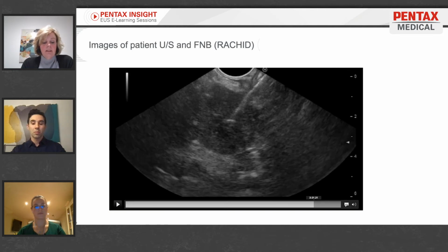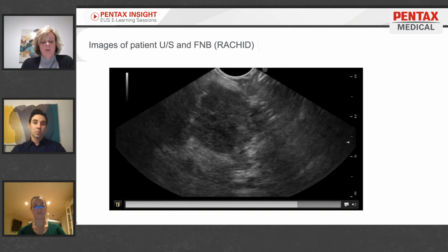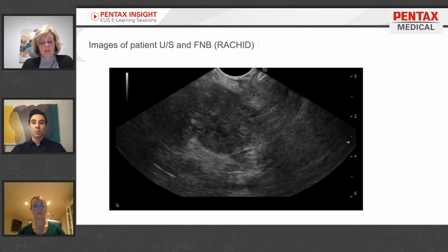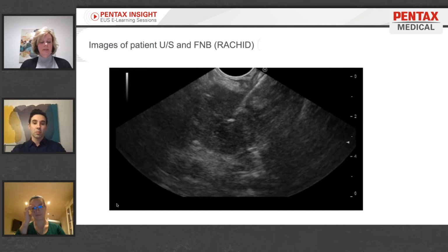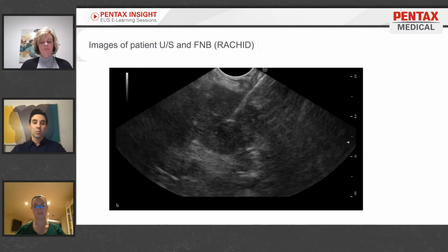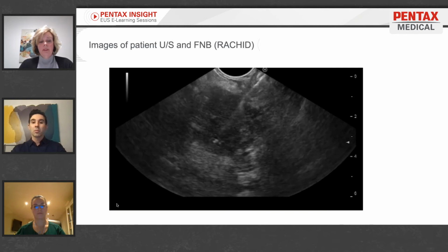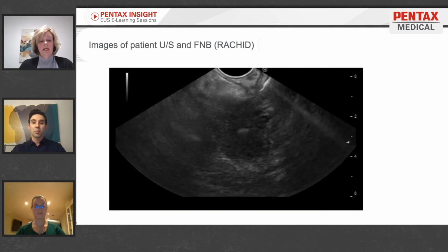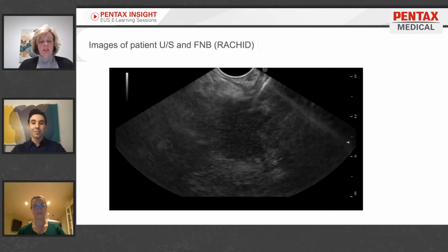Prior to obtaining the specimen, the endoscopist should ensure the sheath comes out past the transducer. If this is not done, then when the needle is deployed, it could penetrate the distal end of the scope, causing a costly repair to the EUS scope. The endoscopist will pull back the stylet from the distal tip and insert the needle into the target tissue. The stylet is pushed forward and then removed from the needle. The stylet is going to be used later on, so keep it in a clean, safe place and preferably not under the patient's pillow.